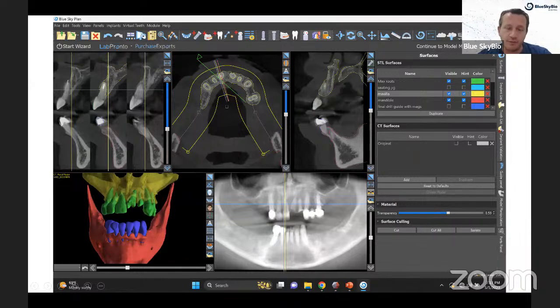In the app, one of the new AI features that we have is the ability to snap a photo of the patient smiling, and within around a minute, you get back the patient with a much improved digital tooth setup. So that's for a 2D photo. What Cory's explaining is probably more accurate, but you should definitely try out the iSmile Teledentistry app. It keeps getting better as time goes on, again, because it's AI machine learning. And again, within a minute, you'll get back a 2D photo of the patient with their improved teeth.